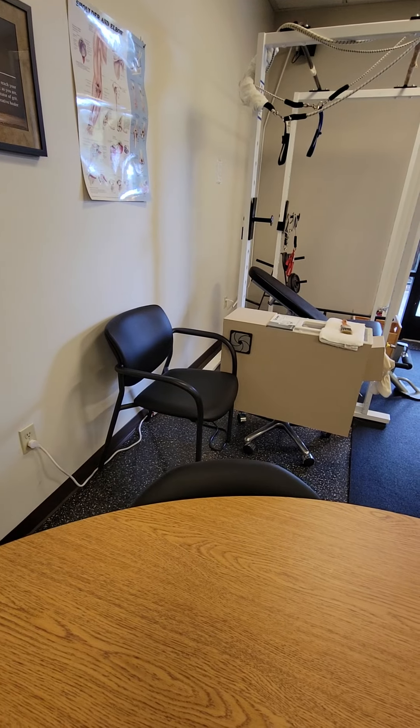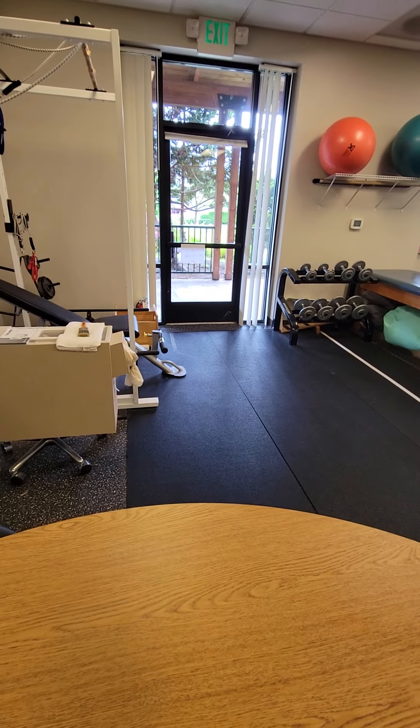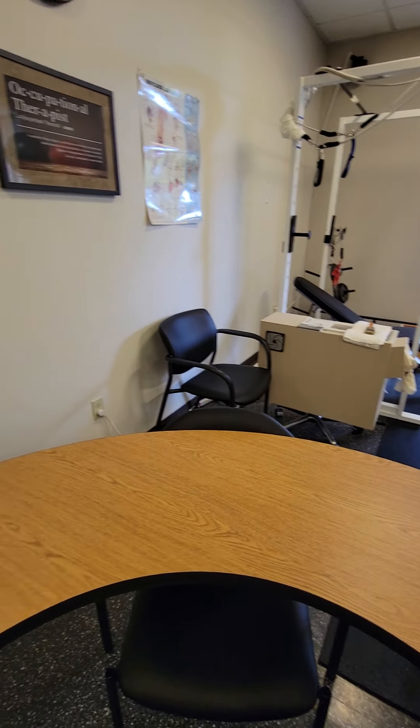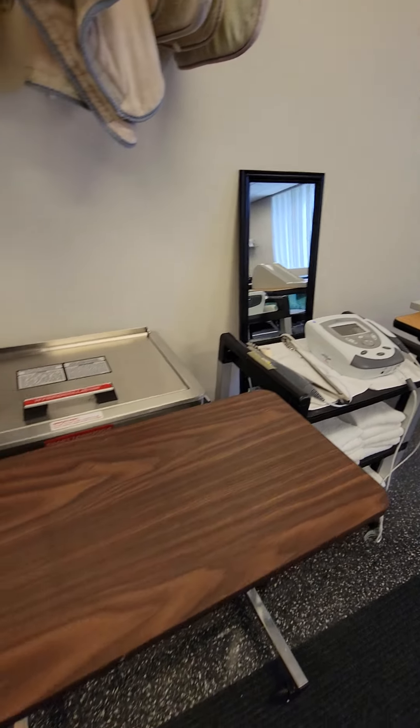Fluidotherapy, just a single unit. Not real hot, but you might need to move it over there by the window depending on what side you need. Ultrasound, and a loose mirror for mirror image therapy if you want.